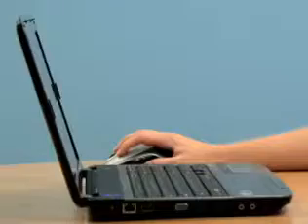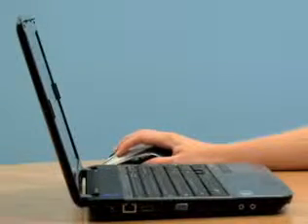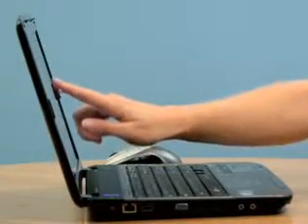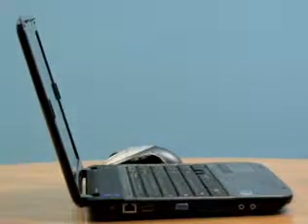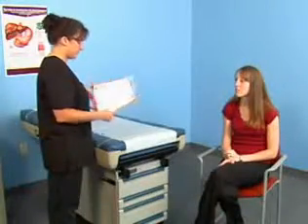If you are employed at a medical office that uses an electronic medical record, compare this information with the demographic data indicated in the patient's electronic record. If the patient was required to prepare for the test, check to make sure she has prepared properly. If the patient has not followed the patient preparation requirements, notify the physician for instructions on handling this situation.